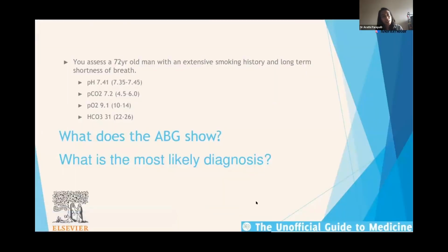With the COPD, even though it's completely compensated, you can see that there's some sort of acid-base disturbance where the bicarb is really high, you're still retaining CO2, but your pH is in normal range. So you can see these different processes going on behind the pH. Even though pH is normal, there are a couple of things happening.